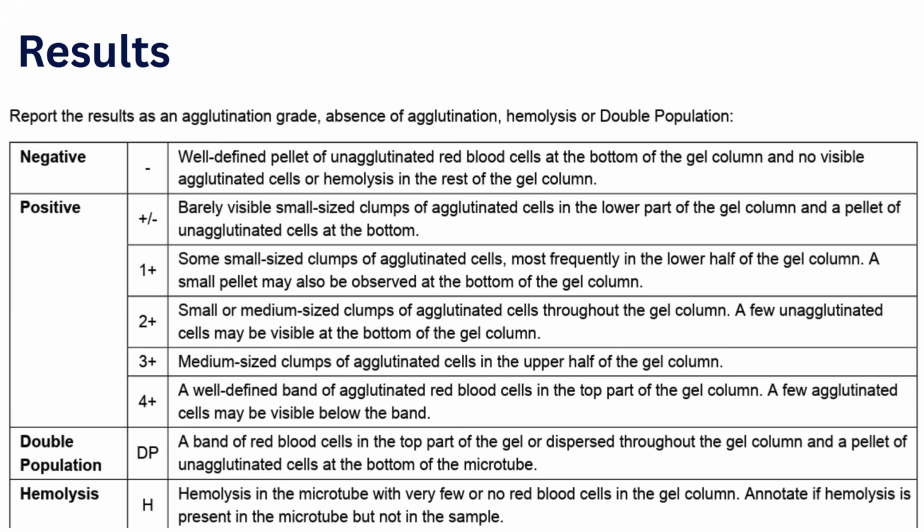If you ask me what the source of this slide is: the first one, the grading of reactions, was based on Harmening's Modern Blood Banking book. This one is from the product insert of our DG Gel Coombs gel card technology. So let's go over it one by one.